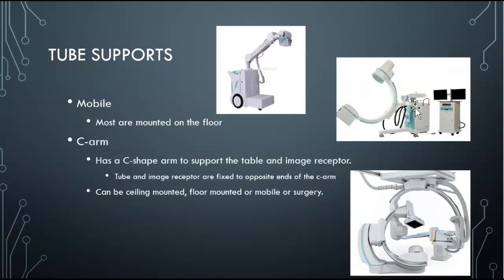Okay, so there's mobile and there's C-arms also. So mobiles are mounted on the floor, and as you can see here, we've got a whole base unit and an arm like a giraffe's neck that comes out, and we can position for the patients. Then we have a C-arm where it's locked on a C. So this is a C, so we call it a C-arm. So these C-arm devices usually have a monitor, and they're used for fluoroscopy.